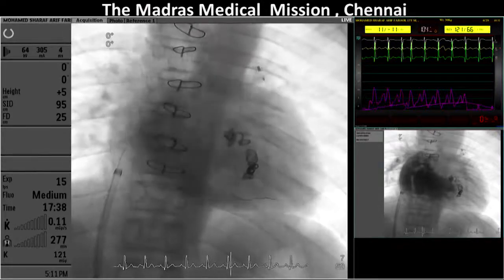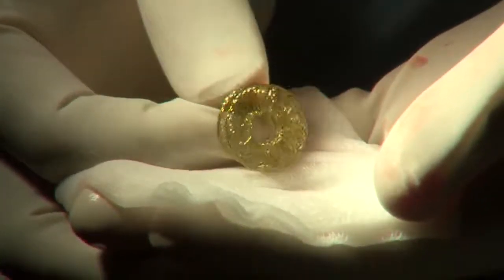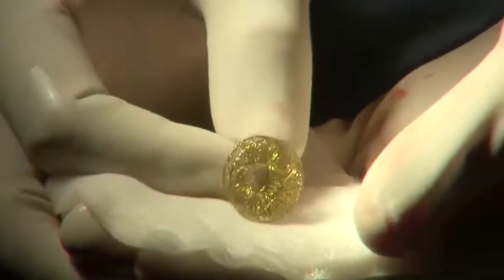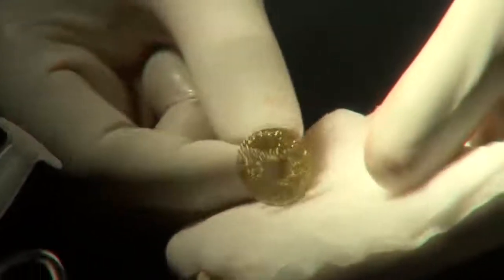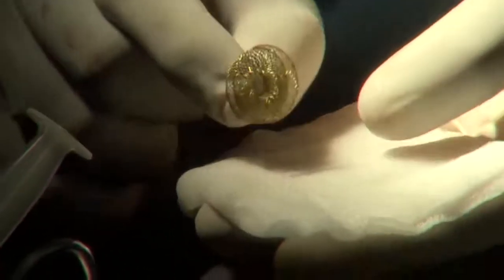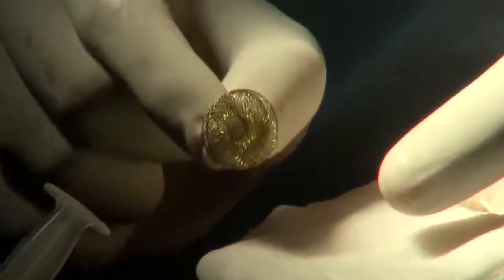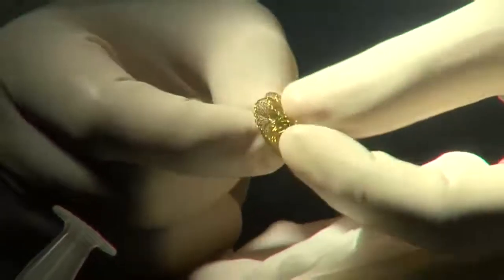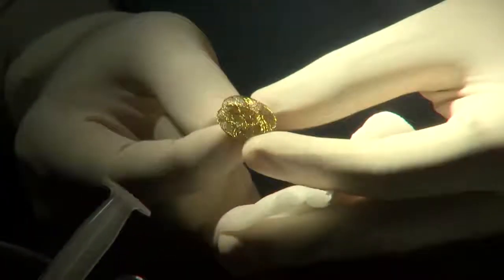Yes, this is Nikolaus Haas from Germany. Hi, Nikolaus. Hi, greetings to India. Wonderful case, and we have just done exactly the same thing that you want to do in a patient with the same circumstances, and we used a 4 millimeter hole. At the end, our patient improved the saturation from the 70s at rest to the 90s at rest. And still with the 4 millimeter fenestration, I think you still have enough hole to allow decompression of the Fontan pathway. A 6 millimeter may not shrink this hole sufficiently.